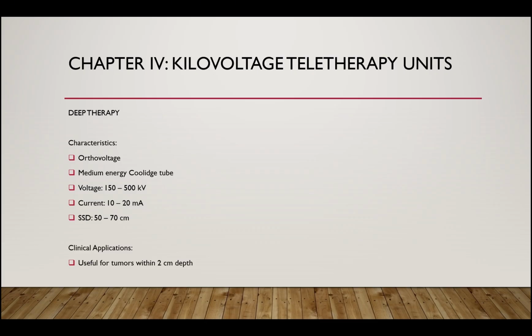So kapag single treatment lang or single field lang, single field treatment kasi, ang ibig sabihin nun ay isang beam lang yung ginagamit natin. Pero we can use several beams directed into the tumor to deliver the desired dose using deep therapy. Okay? Yun yung pwede natin gawin.